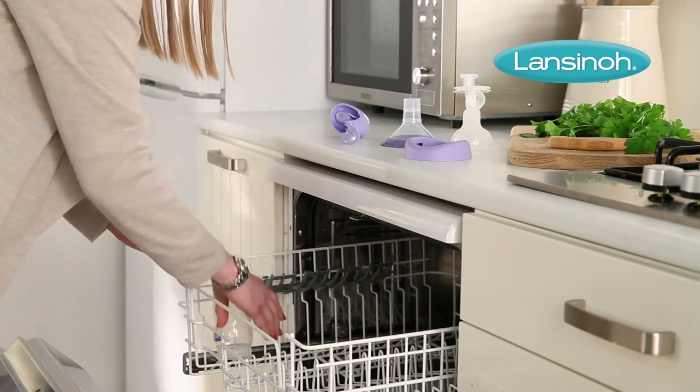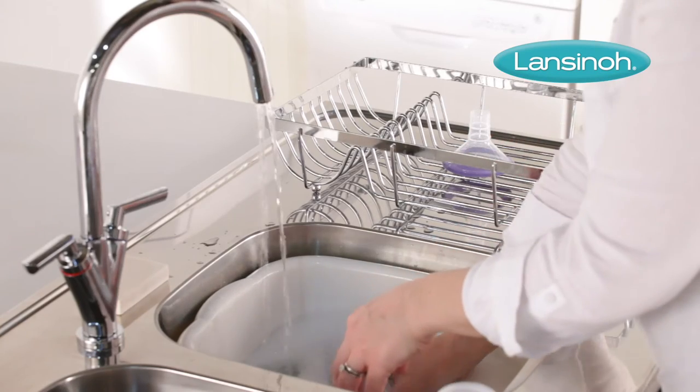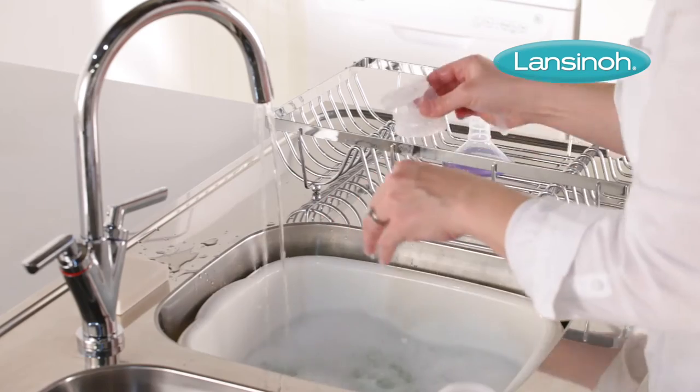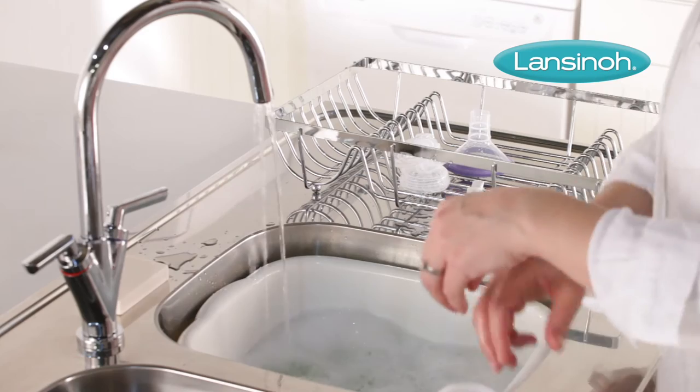The bottles, flange body, and diaphragm caps can be cleaned in the upper compartment of your dishwasher, or hand washed with dish soap and hot water. Be sure to rinse thoroughly with clean hot water. Do not use solvents or abrasives on these parts.